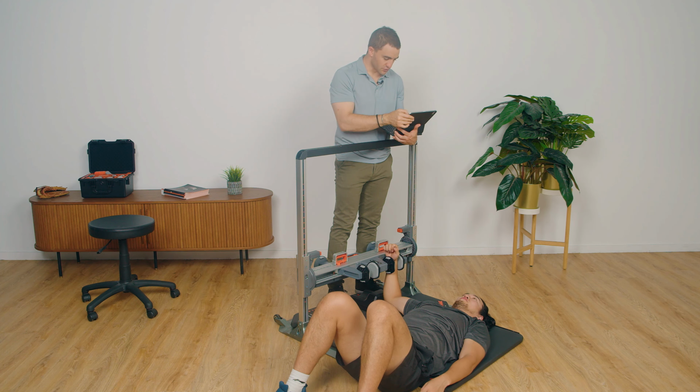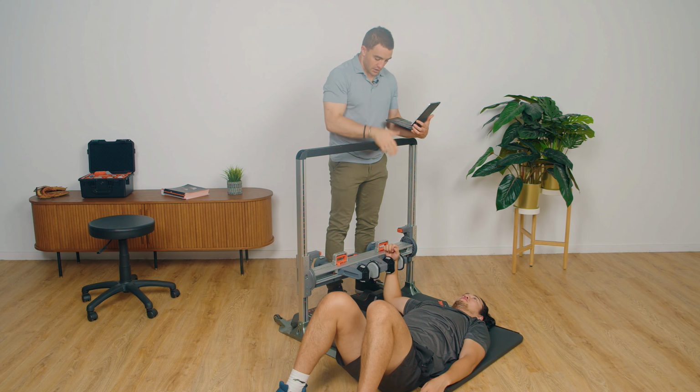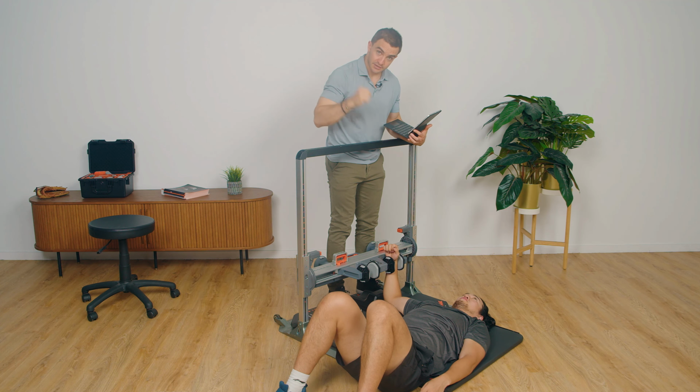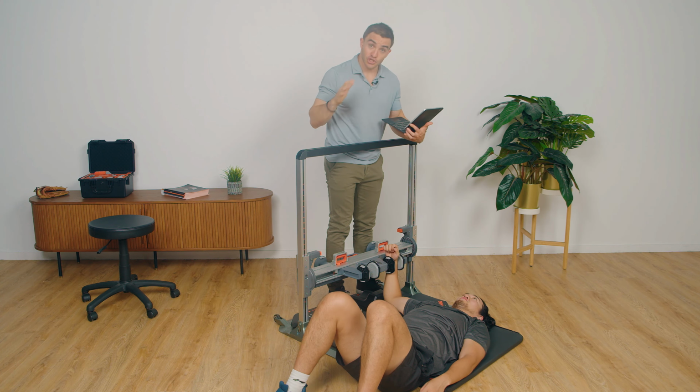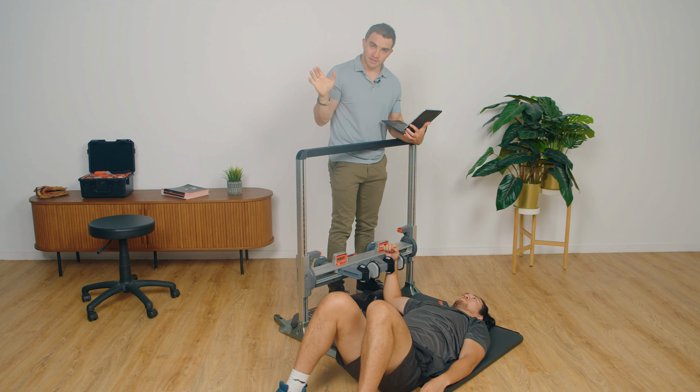So what we'll do is we'll measure external and internal rotation here. Now the other thing I want to make sure of is that Cal's in a nice stable position. In this position, I'm going to keep my feet on either side of the shoulder well to make sure we get as little aberrant movement as possible. And because we're just cueing for strength, I'm going to tell Cal to push as hard as he can, not worry about speed. I'm going to count him down and then he can relax.